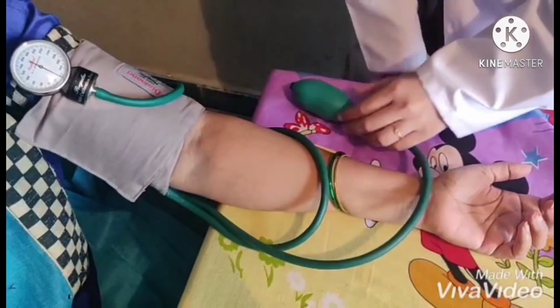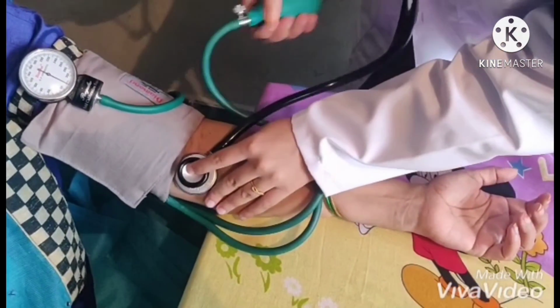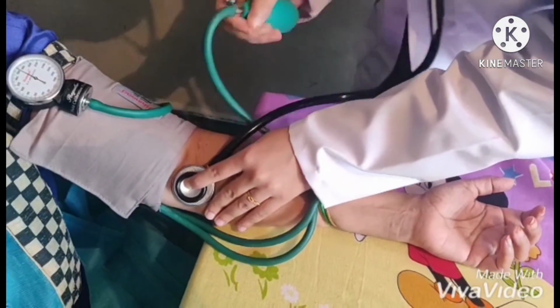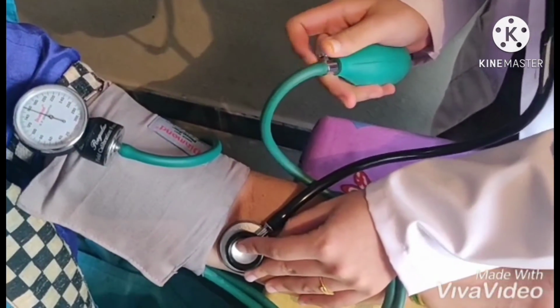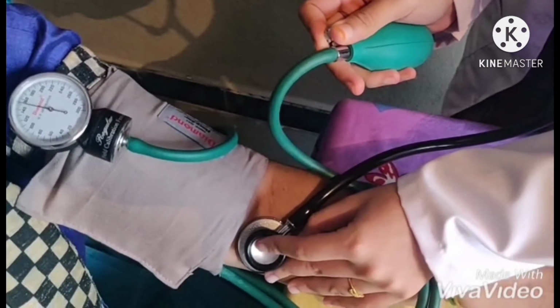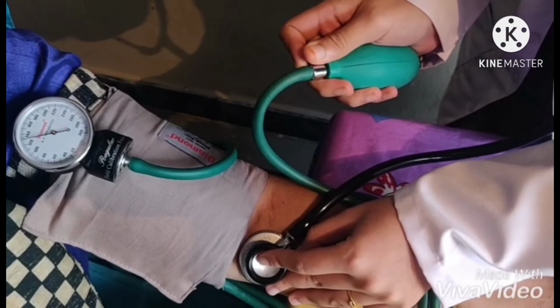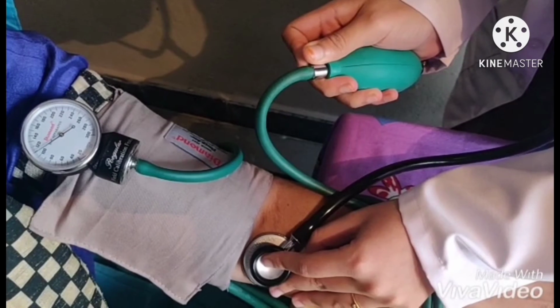Apply the stethoscope lightly over the brachial artery located by palpation. Inflate the cuff to a few mmHg above the pressure observed by the palpatory method. Then deflate it slowly and notice the appearance of a series of sounds known as Korotkoff sounds. The pressure at which sound appears is the point of systolic pressure.